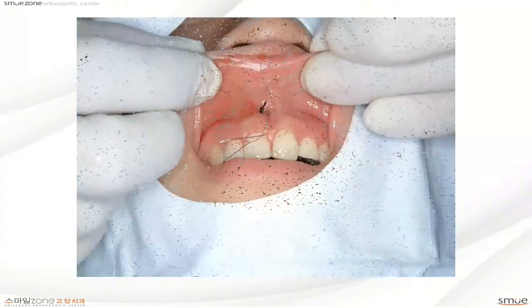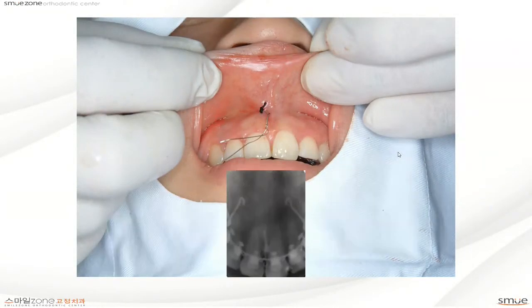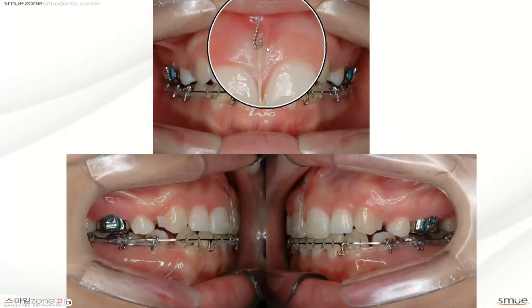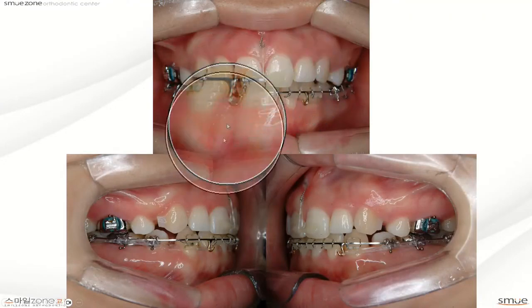Профиль протрузивный, поэтому было проведено лечение с удалением, но в итоге у нас не решалась десневая улыбка, поэтому было решено установить мини-винт между центральными резцами в области передней носовой ости. В этом случае мини-винт устанавливается в подвижную десну, поэтому необходимо сделать разрез и провести закрытый метод установки мини-винта.